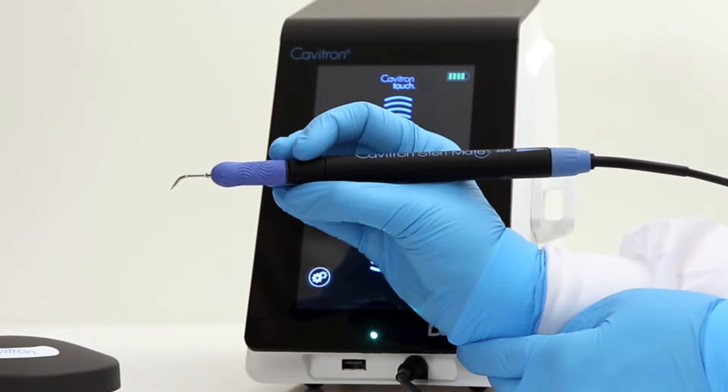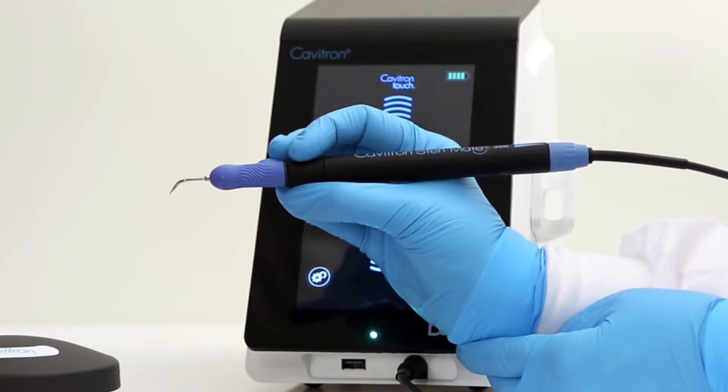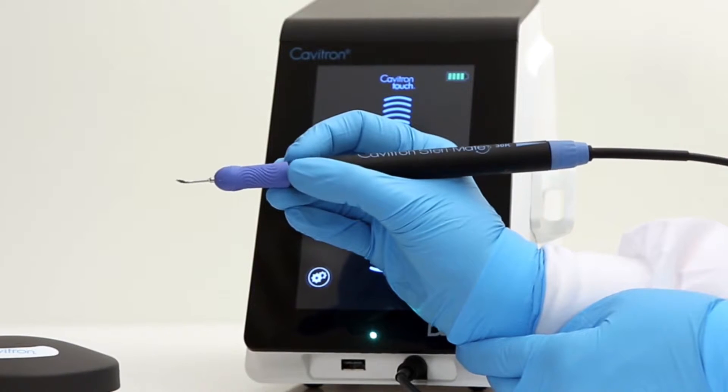To rotate the ultrasonic insert, place fingers on the nose of the handpiece and rotate to your desired position.